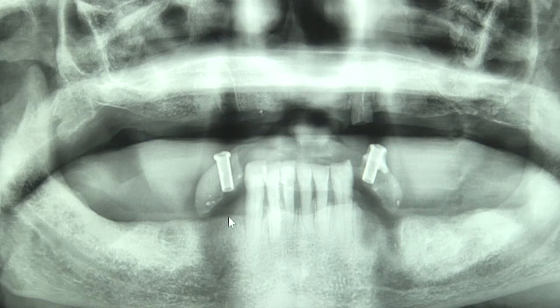So we see it's right here, and now we can follow down and we can see where the mental foramen is located, and we can tell that we can go down at least 12 millimeters in this site without being concerned that we're going to be anywhere close to the mental foramen. Similarly, on the other side, you can see here's the socket of the original tooth that was extracted and the second socket, but you can also see that the mental foramen is located distal, and if we continue to place our implants in these sites, we'll be fine.